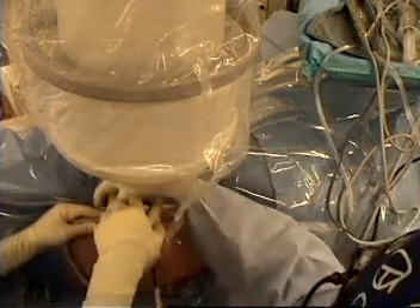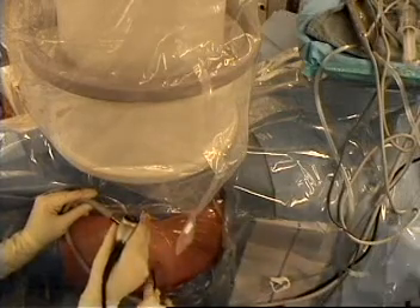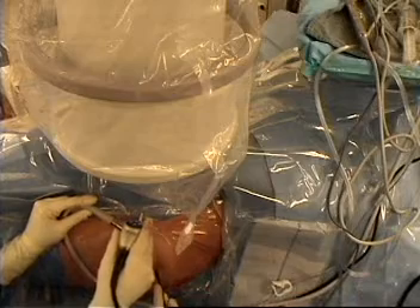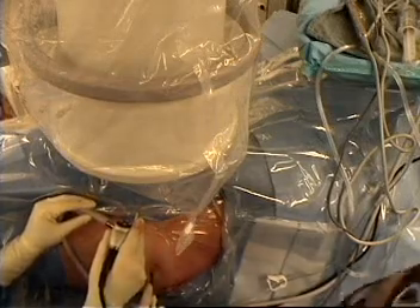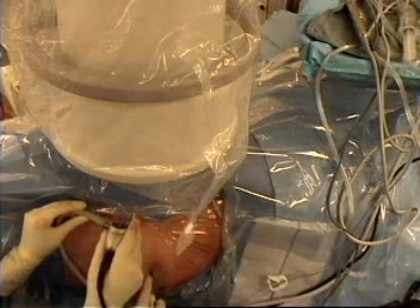So now we are going to elevate. You can see there is a little bit of fraying here — we are just going to clean that up. This is a little bit of cold cautery to seal that. Now we are going to open up the bone area. We are right around the bone here, and this is where we are going to elevate this off.